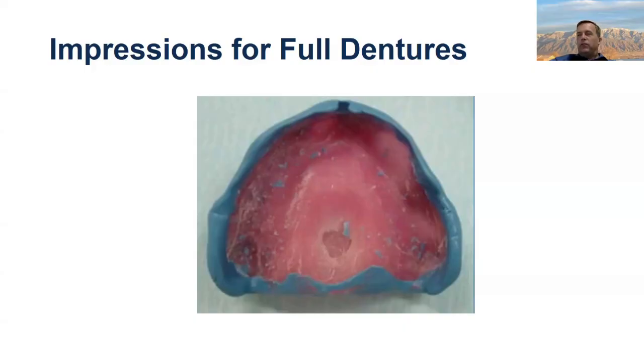One of the things that you can do is, it takes 5 minutes for the adhesive to set up. You can have the patient practice. So for the maxilla, you want them to open and close their bite and then perform left and right excursive movements, and then pull their left cheek, right cheek, and upper lip down to help activate these muscles up here. For the mandible, you want the person to stick their tongue out first towards the right corner of the mouth, then the left, and say oh and suck in their cheeks. And then you want to pull up on the left and the right and the center.